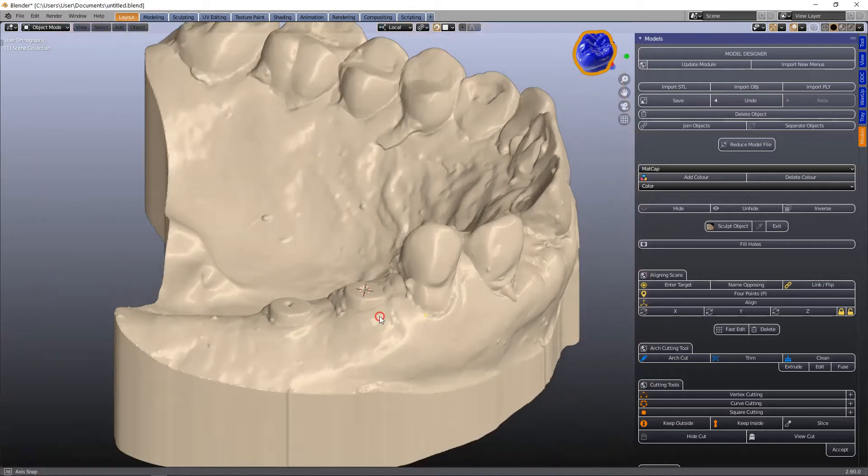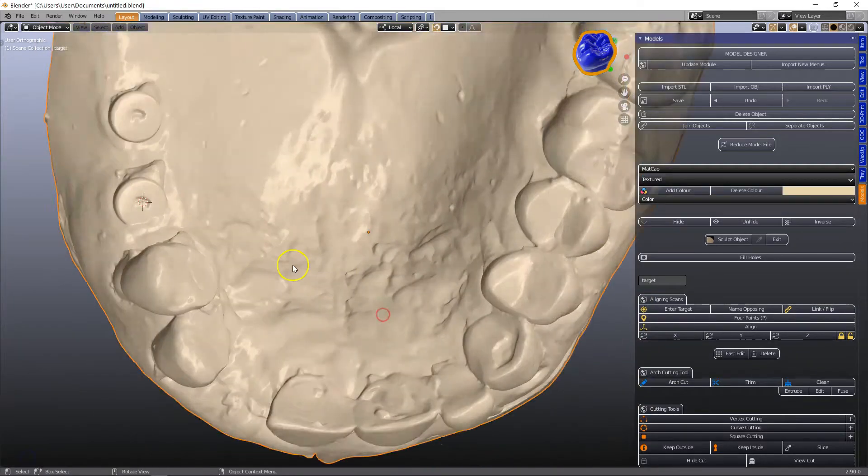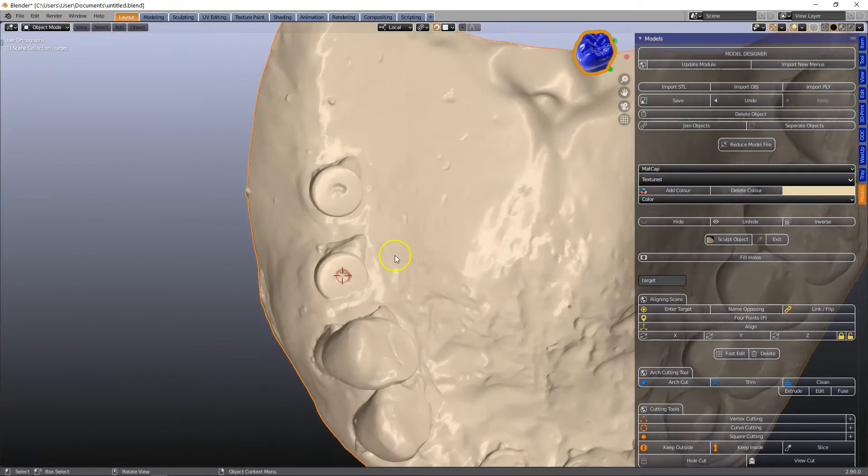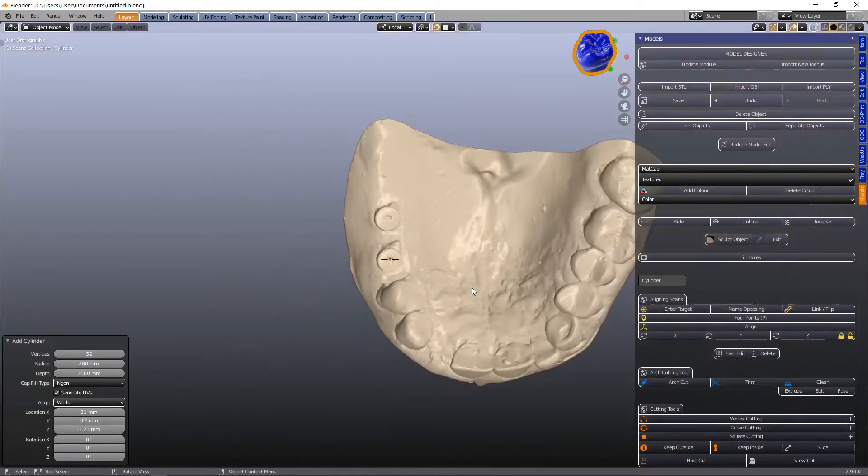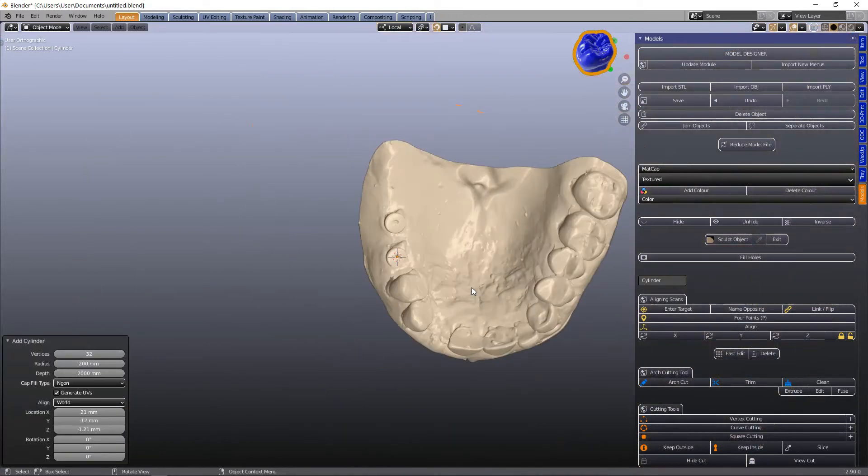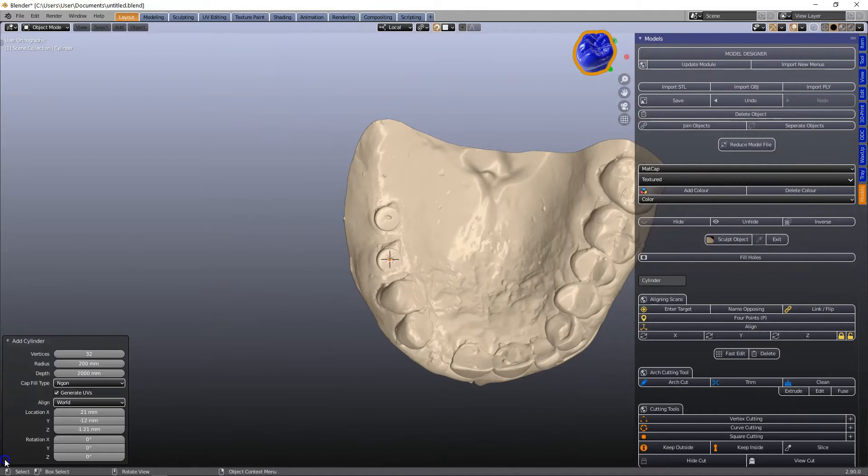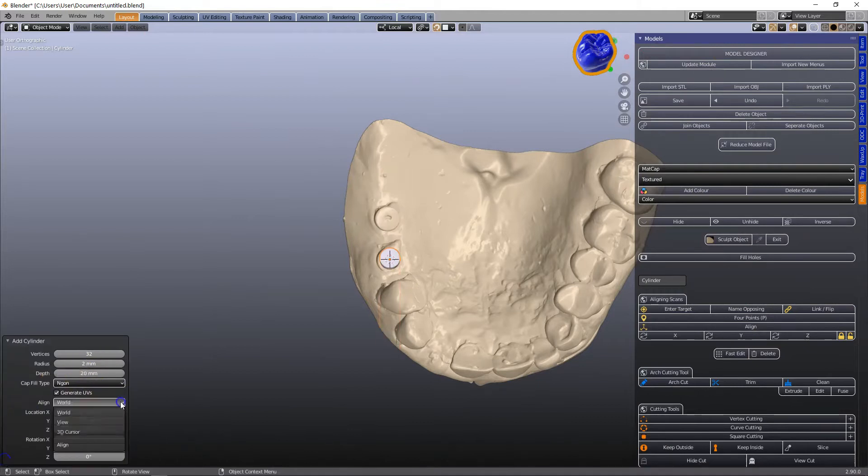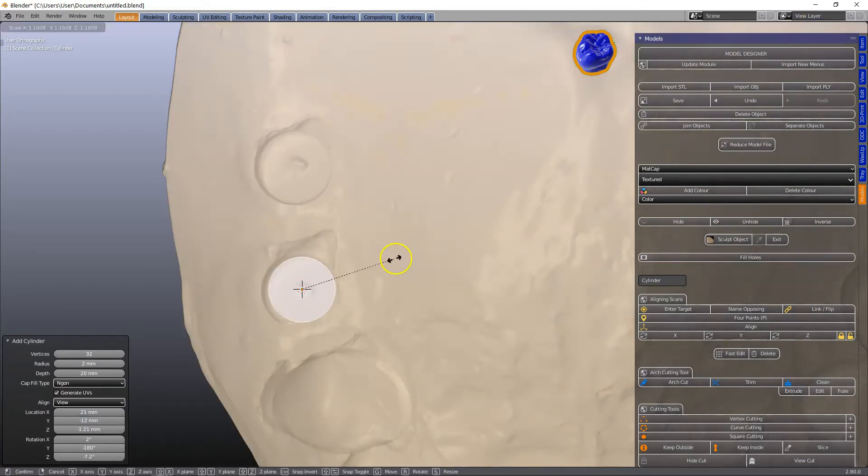Let us make a tray for an implant model. First thing shift A to get yourself a cylinder. The default cylinder is a bit large so we're going to go in the left hand corner and set the radius to 2 millimeters and depth to 20 and align to view.